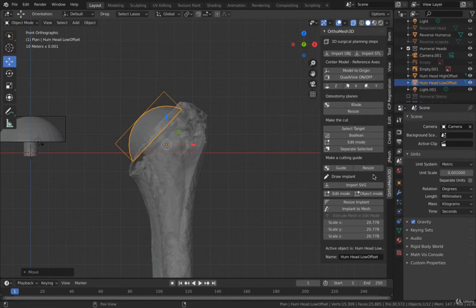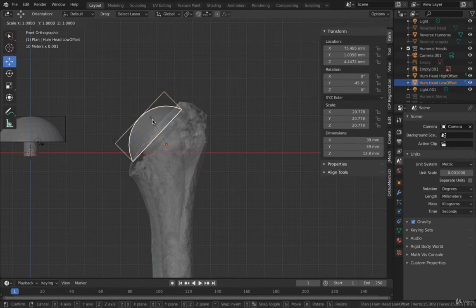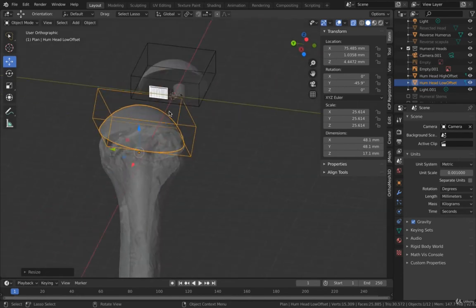And the way we would do this, we'll go under item, and we can see it's a 39, so I'm going to go ahead and click it and then press S on the keyboard and start scaling it. We go to 44, maybe a little bit higher, 44, let's say probably right in there. That's a 52, it's pretty big, so 48. 48 sounds pretty good for this particular problem.